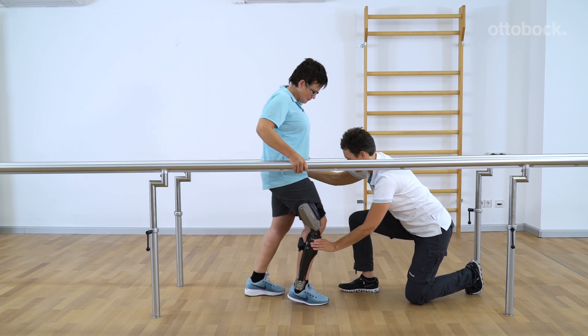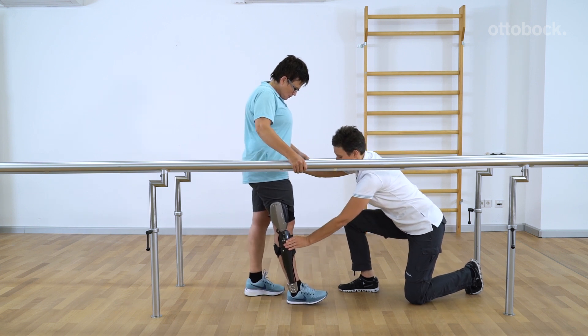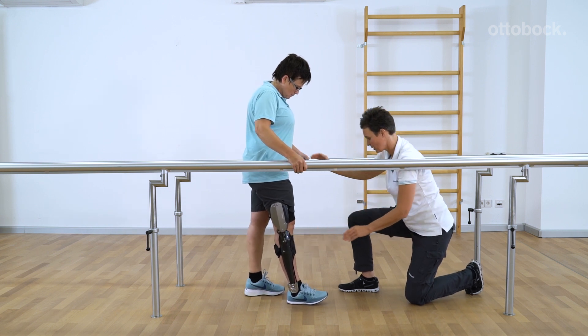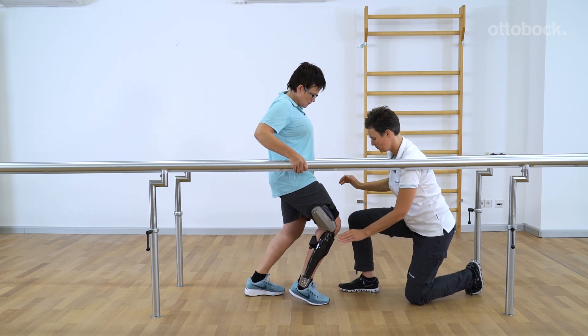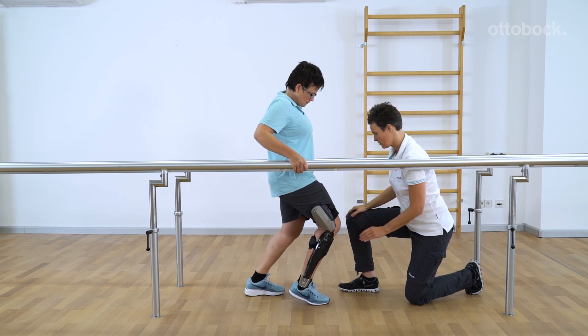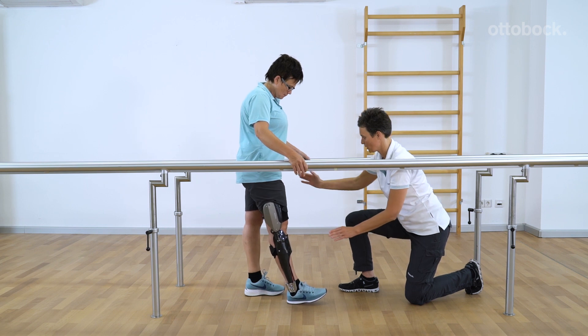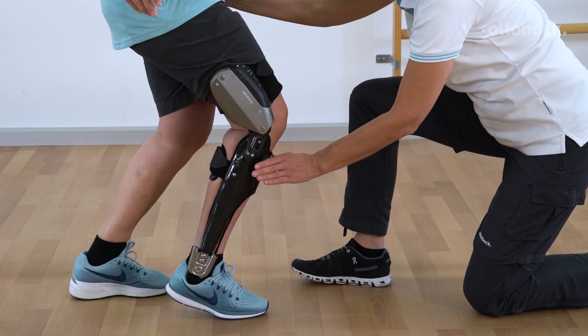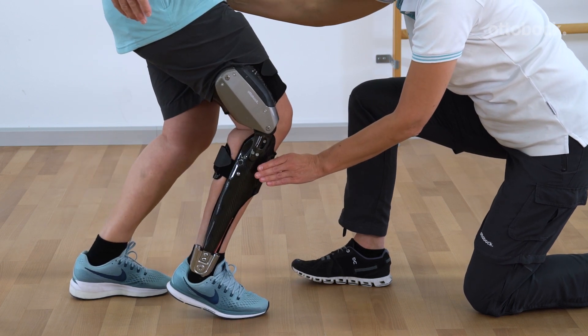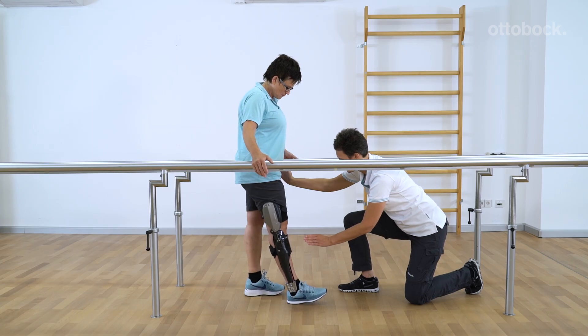The physiotherapist stabilizes and supports the patient in the area of the knee and hip during this exercise. Note that knee flexion is not limited, meaning the patient can fully bend the knee. For this reason, the knee should initially be bent only to the point where it can still be kept stable while standing. Repeat this exercise several times.